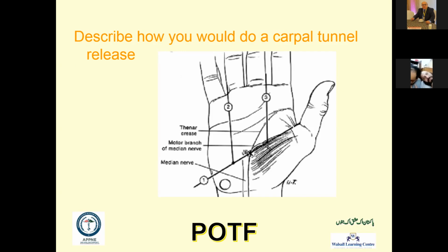Sir, there will be increased latency of the signals. Three things it will show you. From the time of stimulus till the time the first wave comes up, i.e. the latency, it is prolonged. The complex duration is longer. Yeah, it takes longer for the nerve signal to pass. And third, the complex is shorter. So these are the three pathognomonic features of carpal tunnel syndrome.